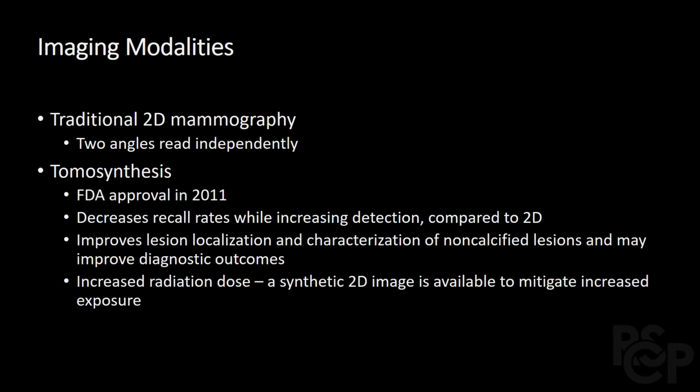Until recently, mammograms were limited to 2 dimensions. However, in 2011, the FDA approved 3D mammography, also known as tomosynthesis. This modality utilizes a moving X-ray source and detector to produce a series of 2-dimensional images that are then synthesized to construct 3D images of breasts with thin slices.